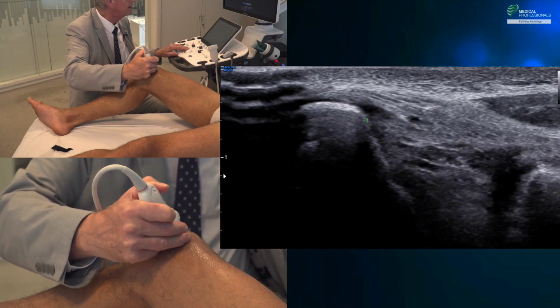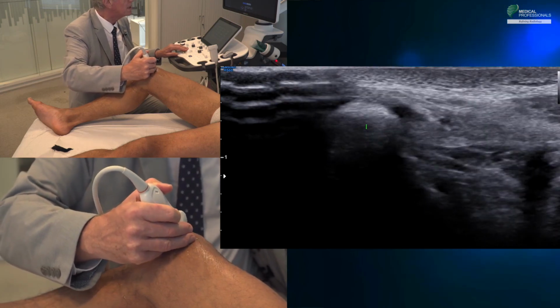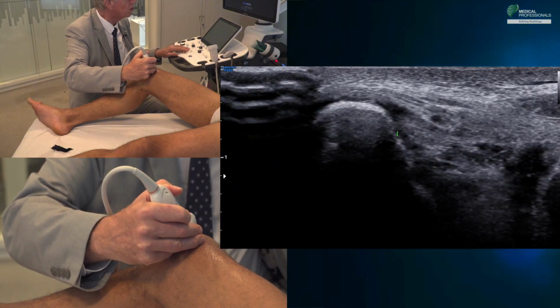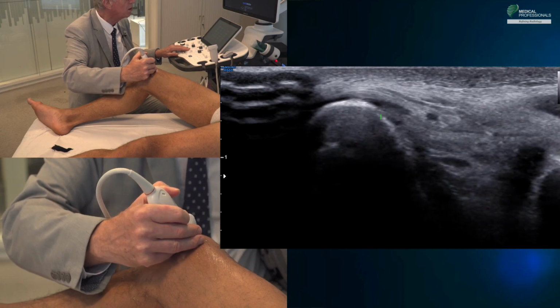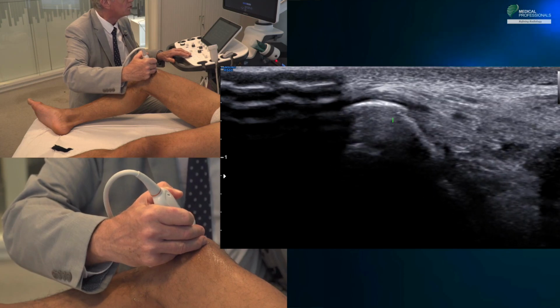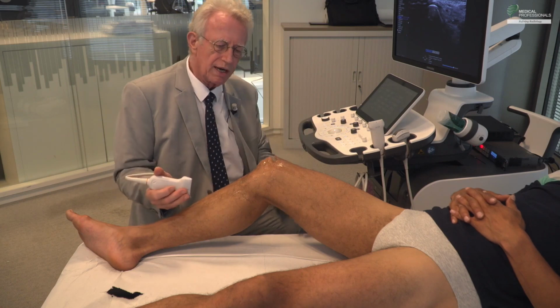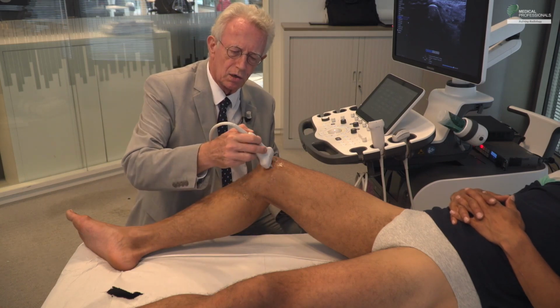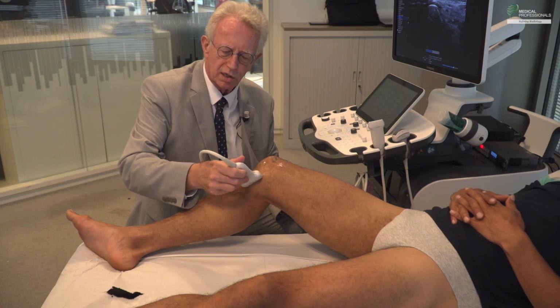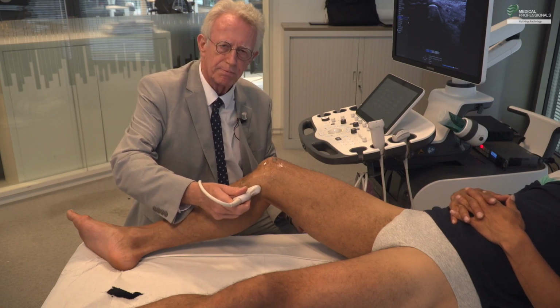In reality, after dislocation or subluxation of the patella, we will see here small cortico-periosteal detachments. There may even be real tearing that is easy to spot on this section in slight flexion, or possibly even on a simple standard radiograph in the axial projection. Here then, to summarize for the medial plane: the retinaculum in slight flexion, the medial collateral ligament, the meniscus, and do not forget the reflected tendon of the semimembranosus muscle in the posteromedial part.